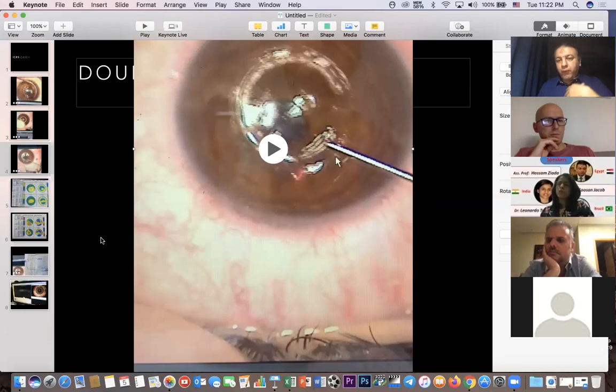So really, I don't believe in that, because I have had a lot of patients with vision worse than 6/60 but with good corneal thickness. I always respect the corneal thickness along the track, not the thinnest location. If the thinnest location is away from the track of the ring, I consider the corneal thickness all over the track of the tunnel to be the thickness that matters. If it's more than 400 micrometers, I will put the intracorneal ring. And I have found a lot of surprising cases.